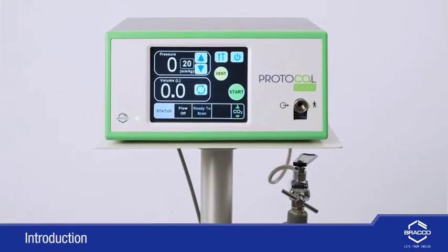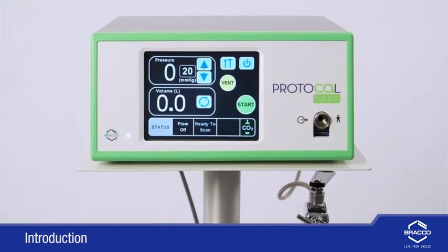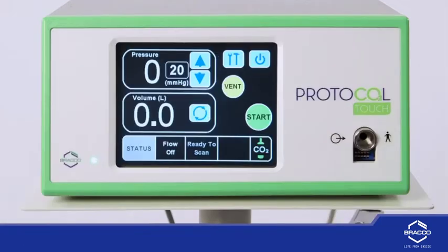Welcome. This video is designed to demonstrate the operation and features of the Protocol Touch colon insufflator. The Protocol Touch includes a range of features and benefits to enhance ease of use and patient comfort. Let's get familiar with the front panel controls and features.